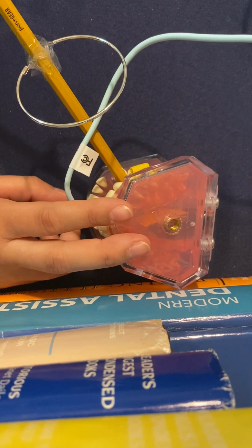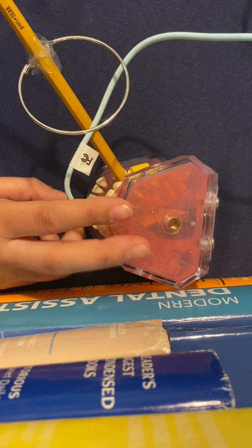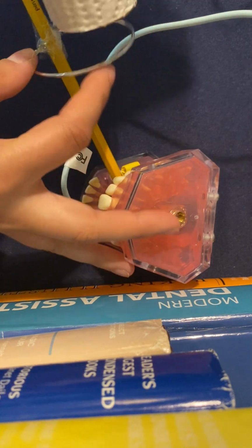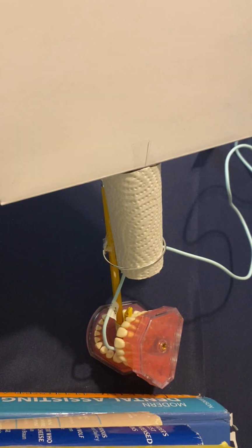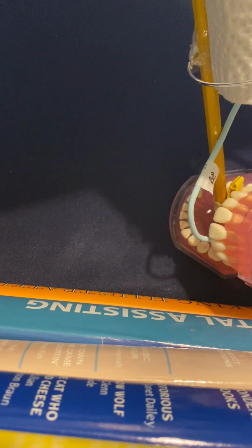Anyway, you're gonna want to point down from the pupil to the mid cheek area. So, like I said, this is his nose, so his cheek's gonna be right here. See if I can hold it, much like that. Normally the PID, but that's the only thing holding that up.